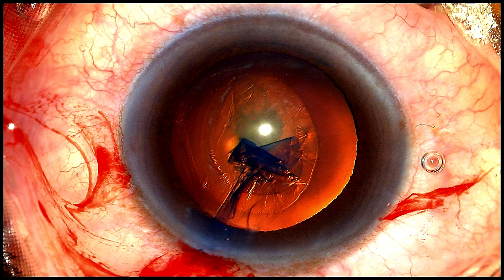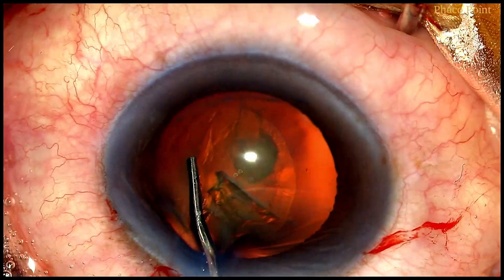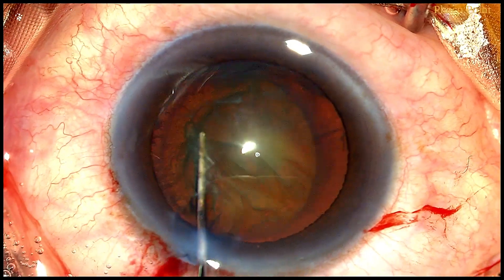Let's now watch the rest of the surgery and understand the merits of having an oval rhexis. Starting with hydro delineation: some excess viscoelastic is removed from the anterior chamber, the hydrodissection cannula then impales into the depth of the nucleus, and a jet of fluid is injected, resulting in the creation of the endonucleus.